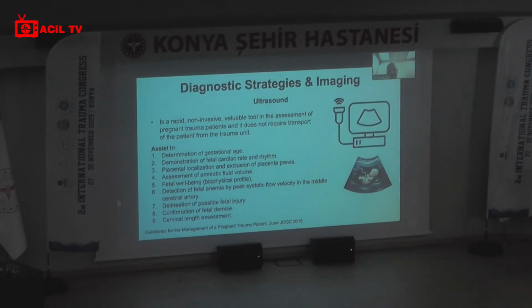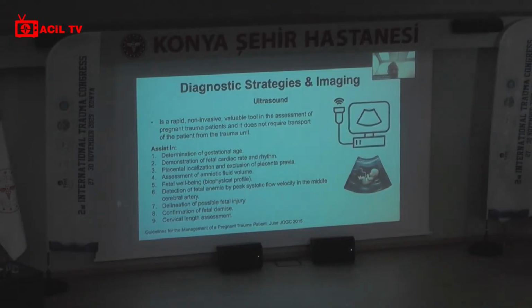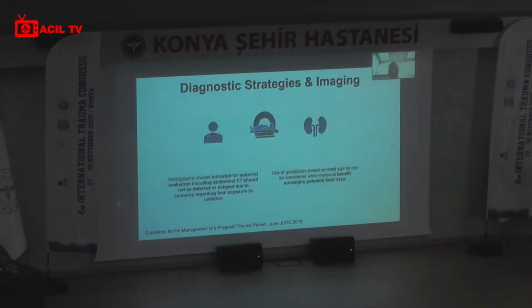For the mother, it's important to identify the placenta location and any effect on the placenta, the assessment of the amniotic fluid volume, the fetal well-being, and detection of fetal anemia based on the physiological changes, delineating the possibility of fetal injury, and confirmation of fetal demise, or the change in the cervix length for the delivery of the mother.